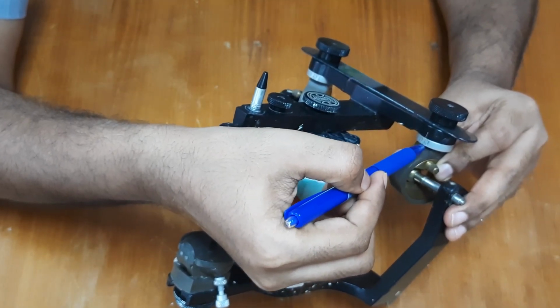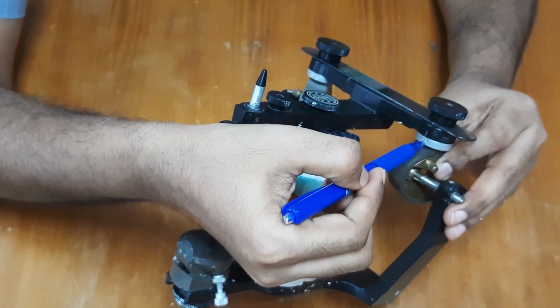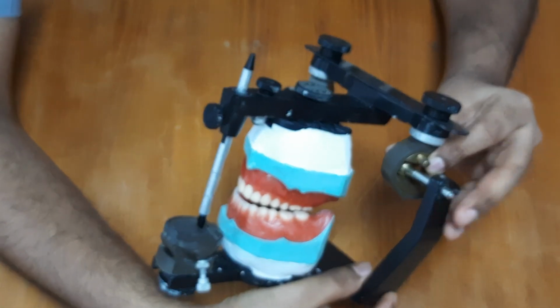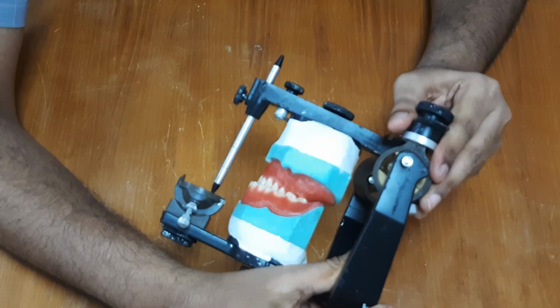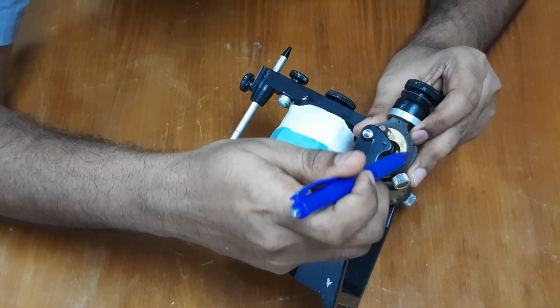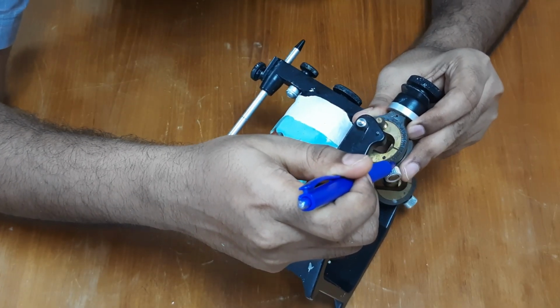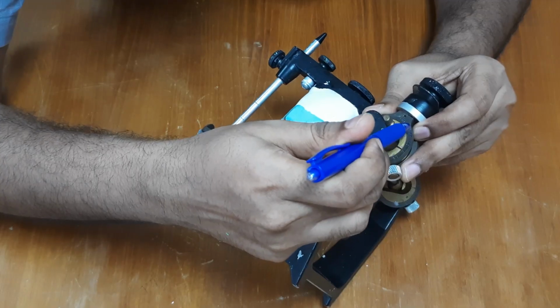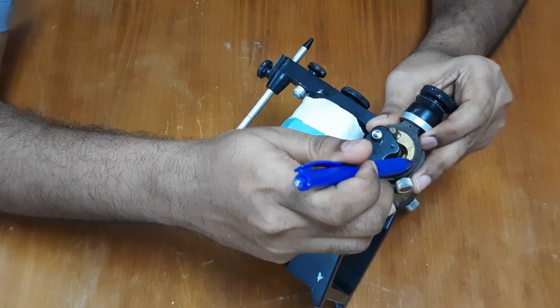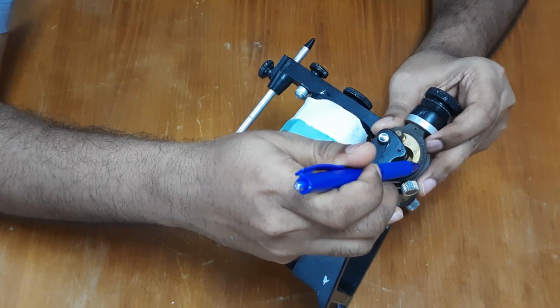This Bennett angle is determined by a formula, which is L is equal to H by 8 plus 12, where H is the protrusive angle. The protrusive angulation is determined by calibration on the condylar element visible over here, from 0 to 20 and from 0 to 50. This is determined by centric and protrusive records obtained from the graphic tracing.